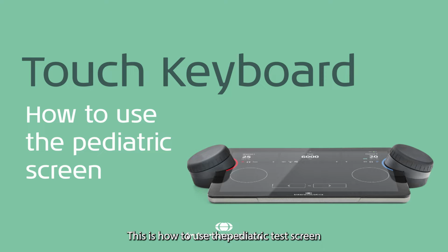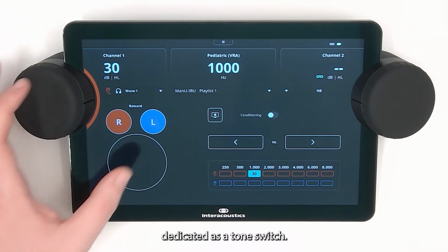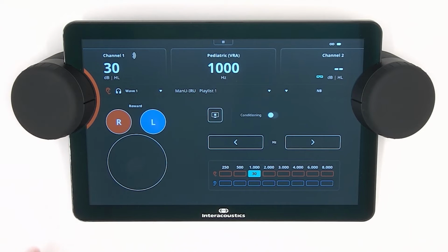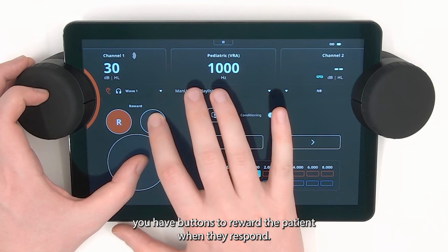This is how to use the Pediatric test screen on the touch keyboard. On the touch screen, you have an area dedicated as a tone switch. Above the tone switch, you have buttons to reward the patient when they respond.